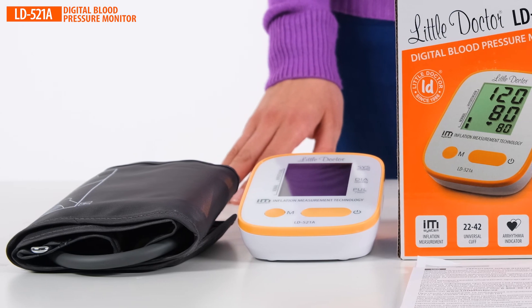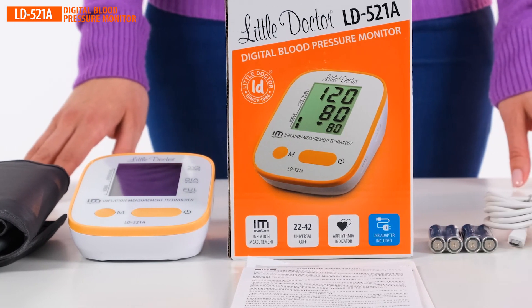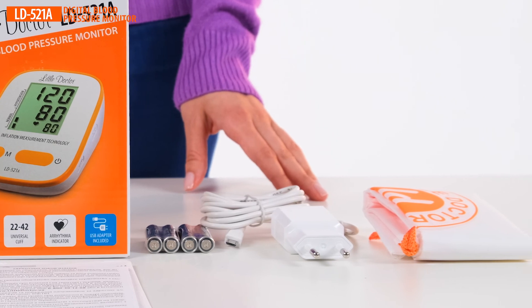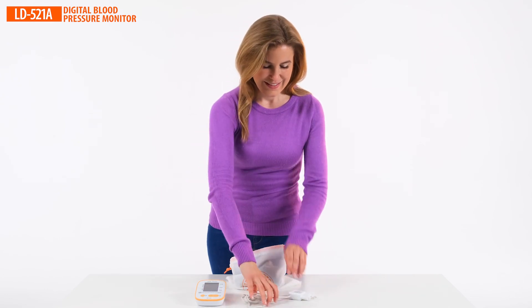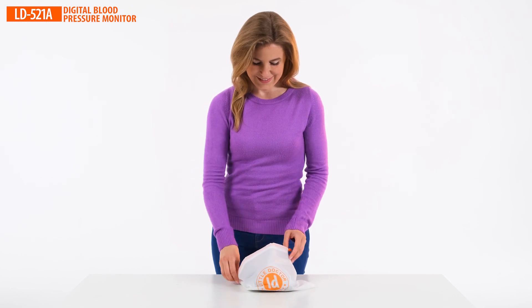Scope of delivery includes: universal cuff, battery pack, certified medical grade power adapter, carrying bag, user's manual, and warranty certificate. The device measures systolic and diastolic blood pressure and heart rate in patients over 15 years old.